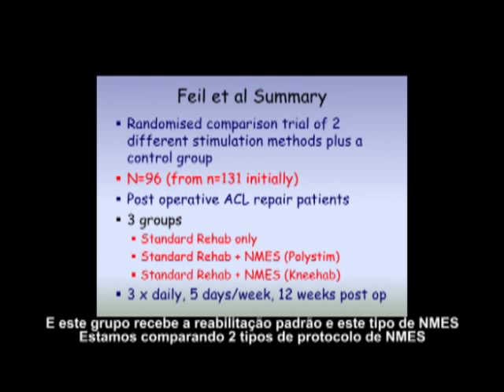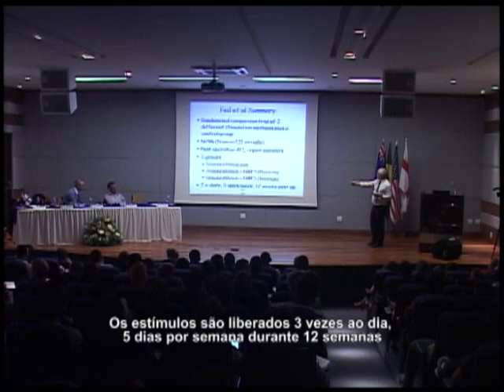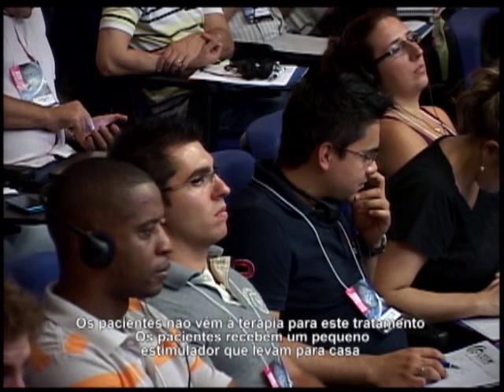We're comparing 2 different NMES protocols. The stimulation is delivered 3 times a day for 5 days a week for 12 weeks. The patient does not come into therapy for this treatment.